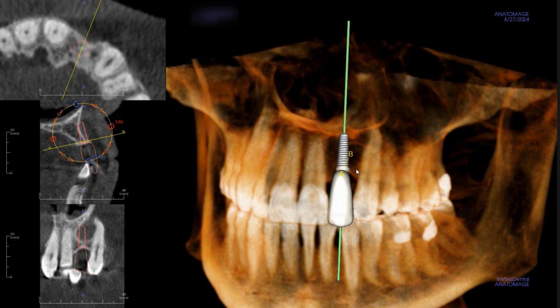I would try to get some vertical bone at the same time, and then do some soft tissue grafting. All of those in an attempt to increase how much tissue we have in this area, hard and soft tissues, so that the emergence of the crown on the implant is as natural as possible, gives us the best aesthetic results, and has the best longevity from a periodontal perspective.